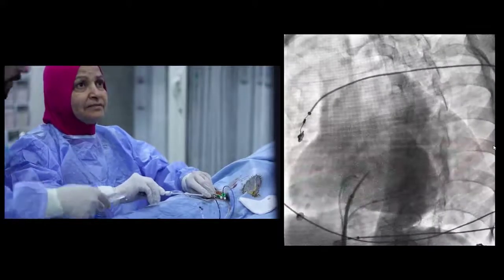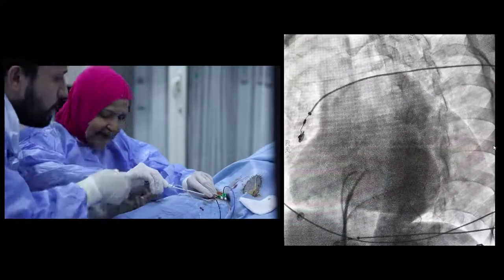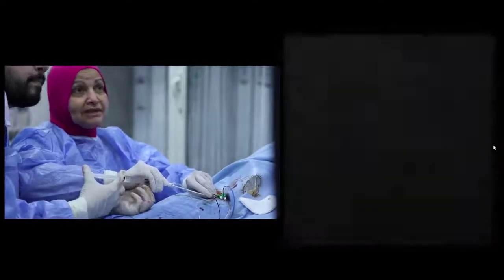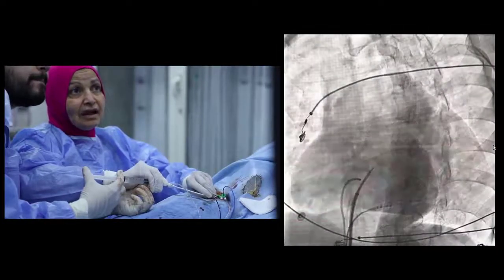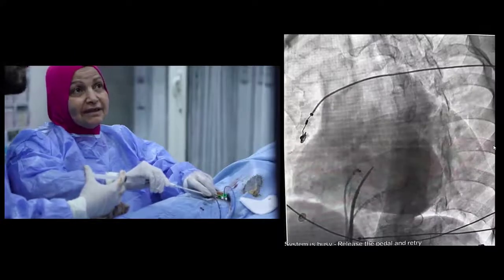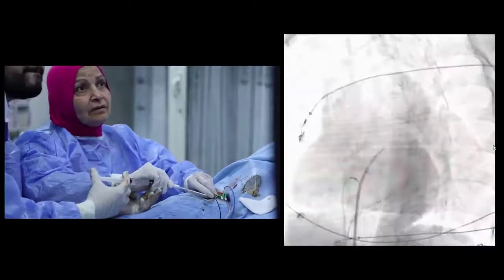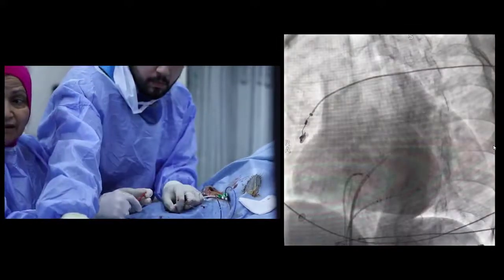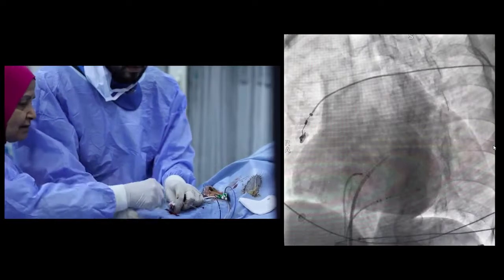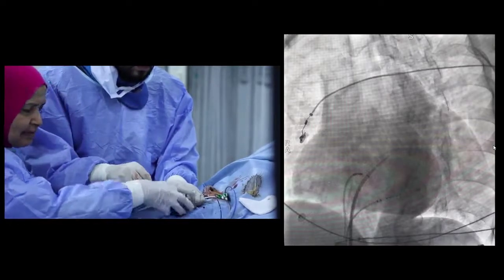We can see the injection of the dye, marking the septum. Then we achieve the transseptal puncture, and we now try to withdraw oxygenated blood from the left atrium.